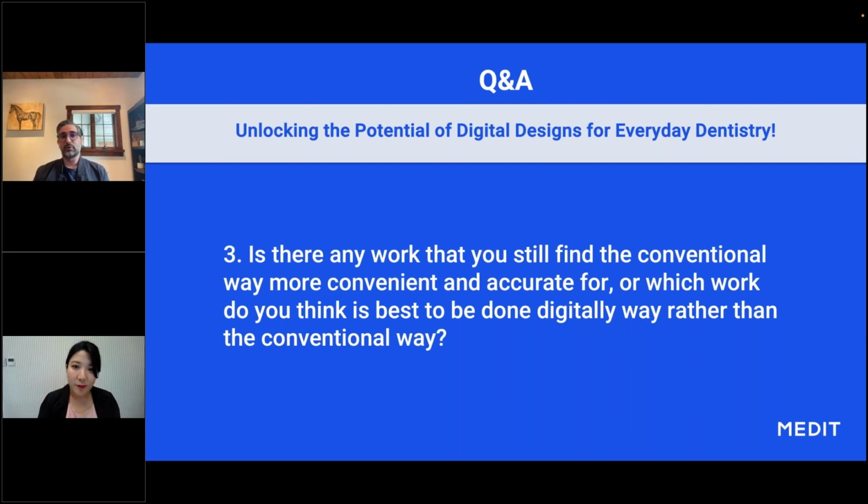still doing in the conventional way to some degree is my veneers, because when it comes to the artistic ability to mimic nature, that's the type of dentistry I do, it's called biomimetic dentistry, then I don't want a monolithic restoration. You can mill something and cut it back, but the most beautiful veneers I've ever done and continue to do are feldspathic. So what happens in those cases is we design them digitally, we come up with the wax up and the shape, but then when it comes time to doing the final production, that design is our guide to make them in an analog way by hand.